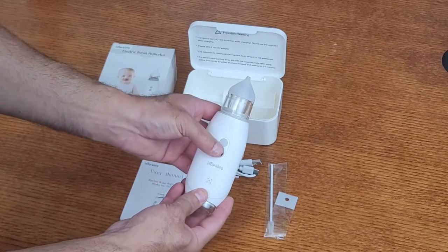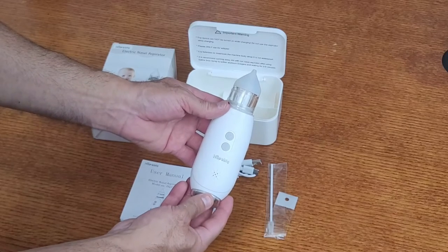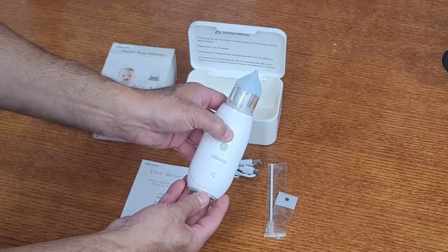It also has a music button right here to help distract your little ones just a bit. To turn off, just press and hold the power button.